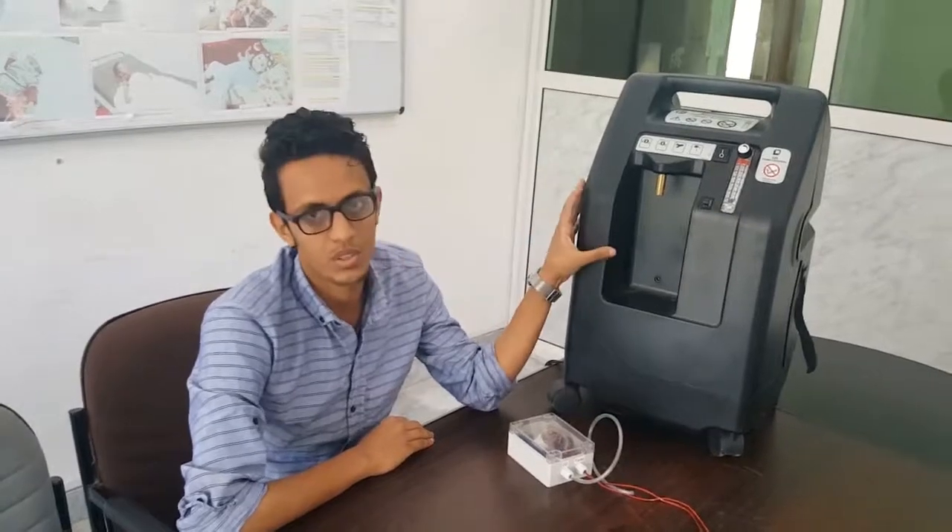My name is Ahmad. I am the mission biomed of NSF OCA in Yemen. In this video, we are going to show you how to turn this oxygen concentrator into an IoT device — an Internet of Things device.